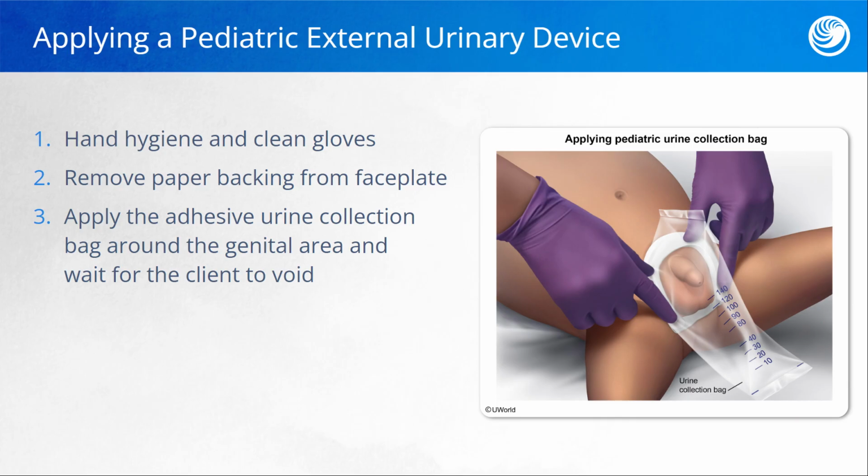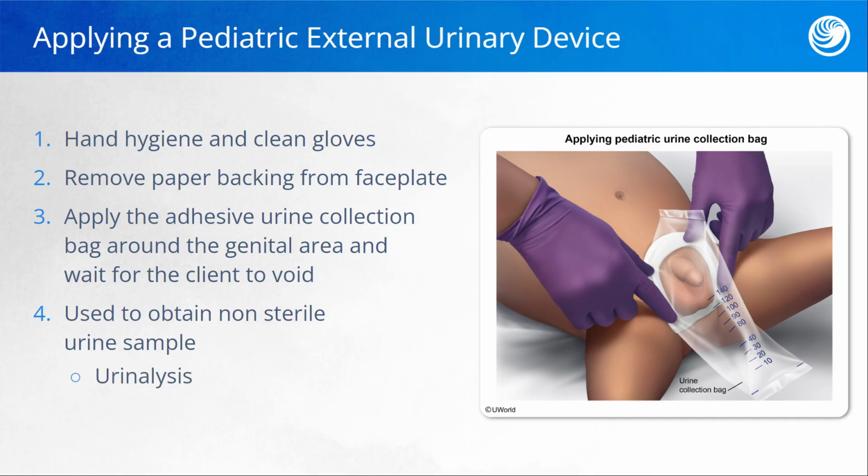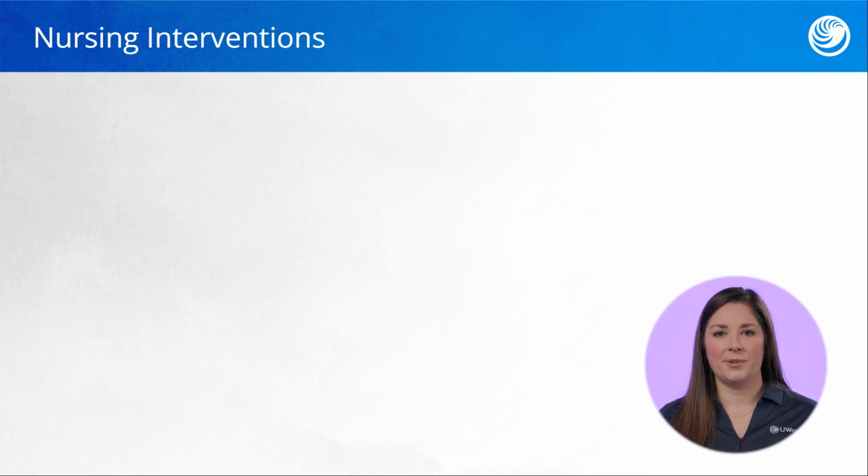These pediatric external urinary devices can assist the nurse in obtaining a non-sterile urinary sample, as well as monitoring urinary output. Now let's discuss important and appropriate nursing interventions to implement when applying an external urinary device.